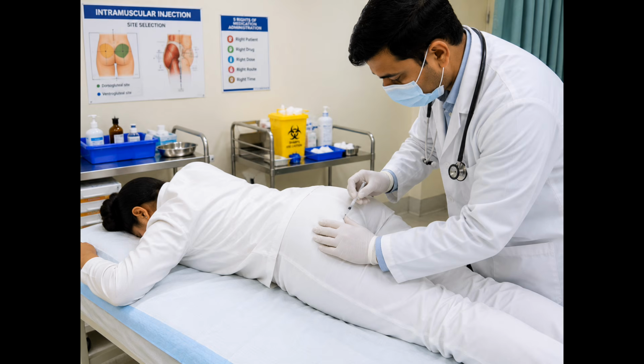Documentation is a vital part of every medication administration. The healthcare professional records the medication name, dosage, route, injection site, time of administration, and the patient's response in the medical record. Accurate documentation ensures continuity of care and supports patient safety. Following the procedure.